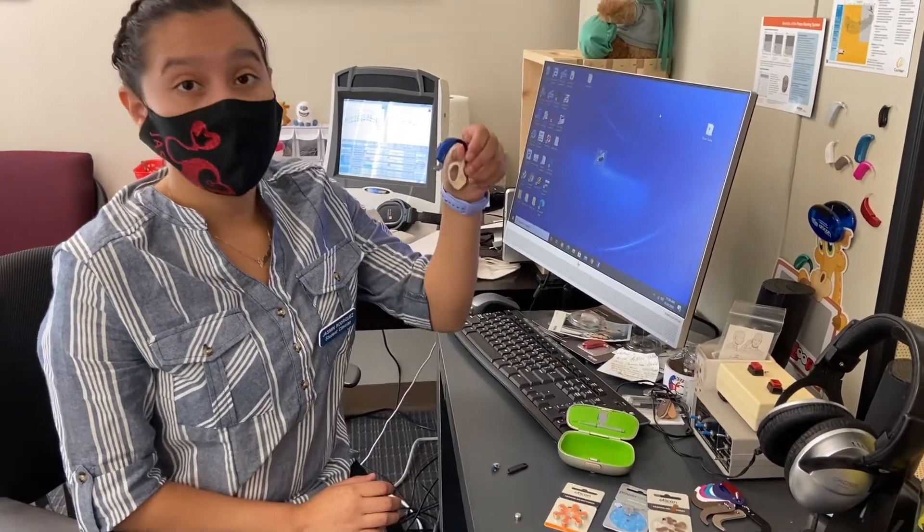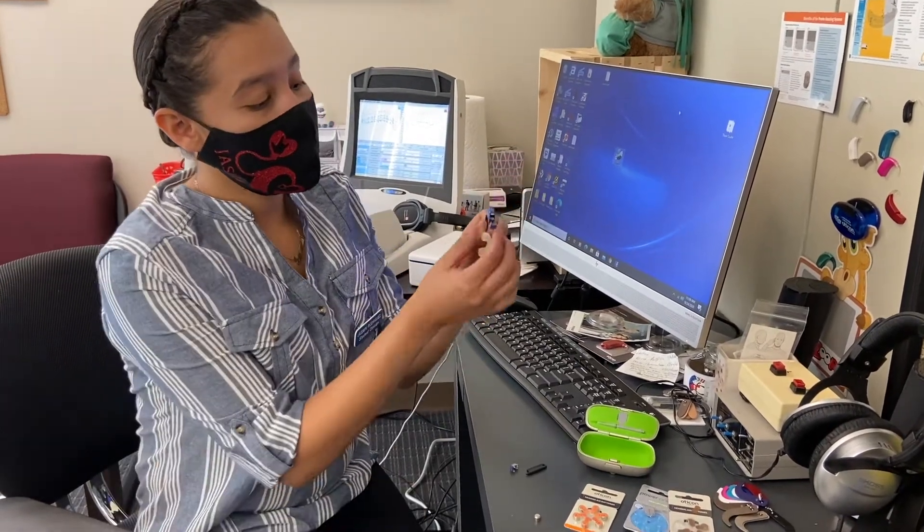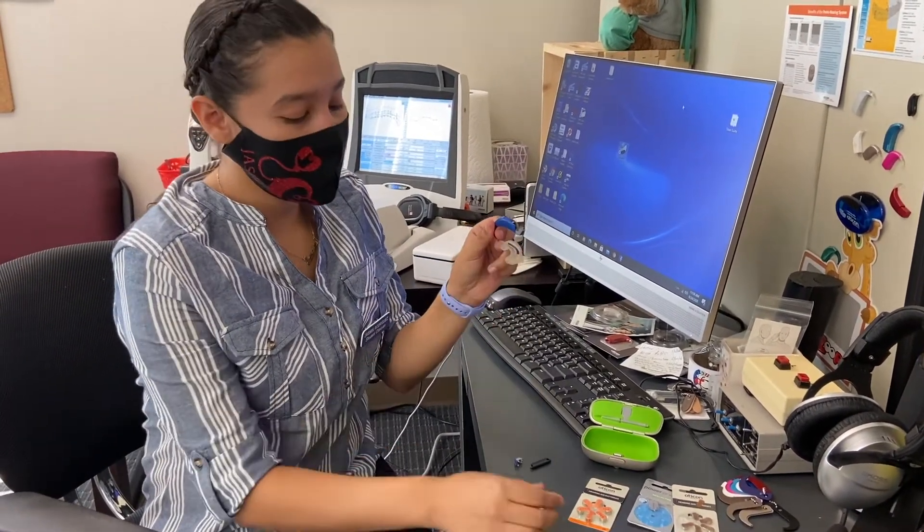This is one of the many hearing aids. It might not look like yours, but they're a similar process. As you know, there's no battery, so you have to place the battery in.